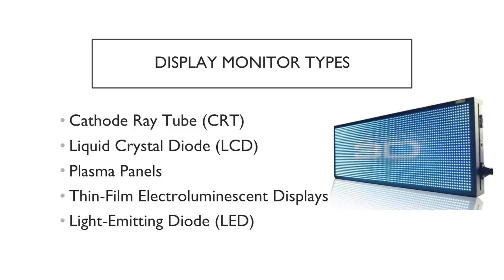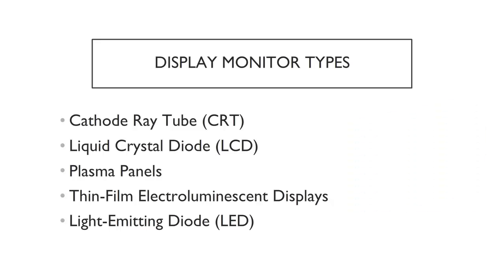Both are similar appearing to the LCD monitor, but not often used to display medical images. And lastly, there are light-emitting diodes, or LEDs. These monitors are made up of a matrix of small light bulbs. LEDs are becoming more prevalent in medical imaging. Historically, CRTs and LCDs were the most common monitors utilized in medical imaging, and so we will spend some time comparing the two by discussing the main advantages and disadvantages of each.